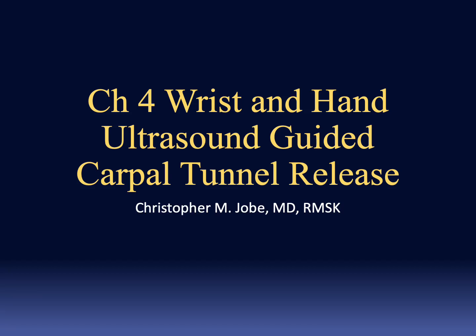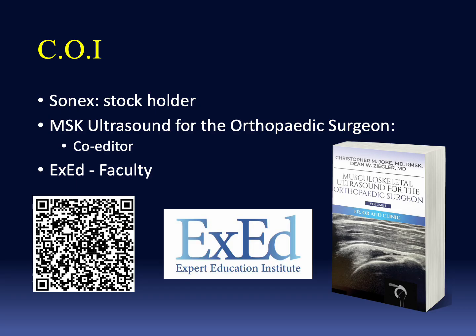Chapter 4, Wrist and Hand. Ultrasound-guided carpal tunnel release, a more typical case.